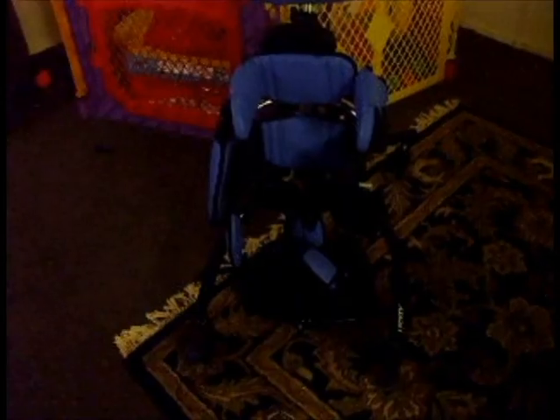Now we just kind of use a high chair, but this thing is called a tumble form feeder seat, and pretty easy to move the seating around for positioning purposes. Velcro attachment, super easy to clean because of the material that it's made from. And right now we really don't have any plans on getting rid of it because we still use it. Like I said, for her to sit up and just have some time up off her belly, off her back, off the floor. But yeah, this is pretty much it.